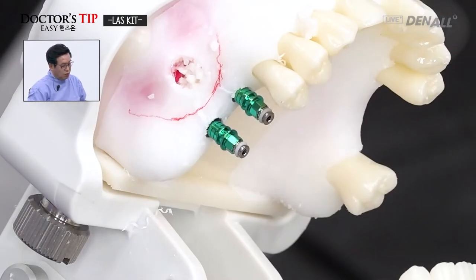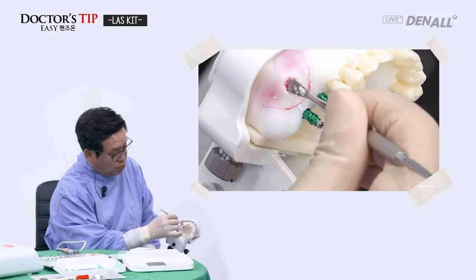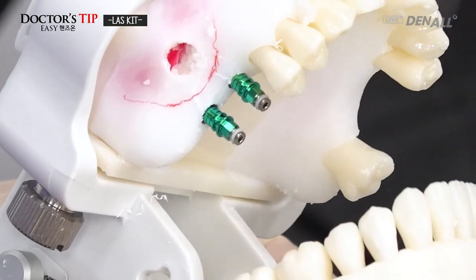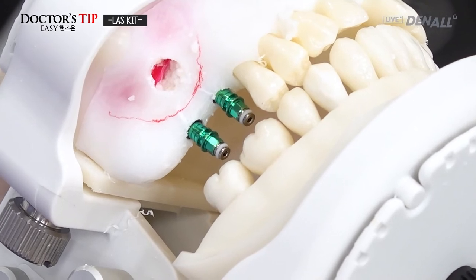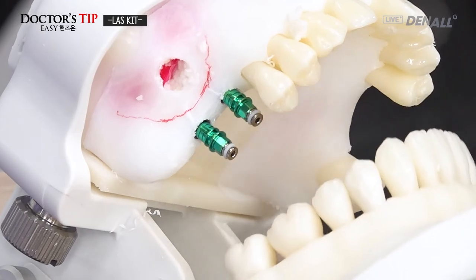And so like this, the implant fixture has been installed and graft material is protruding. So again, put that in place. And after that, you check occlusion. Then, as planned, you see it's been done correctly in the correct site.